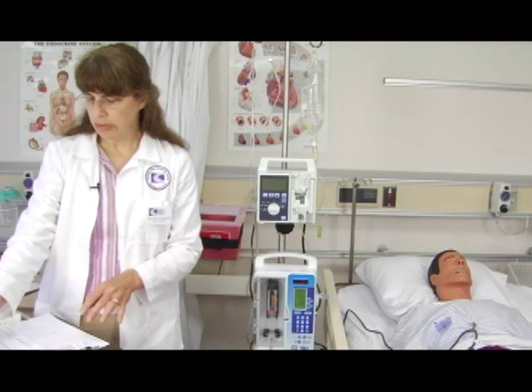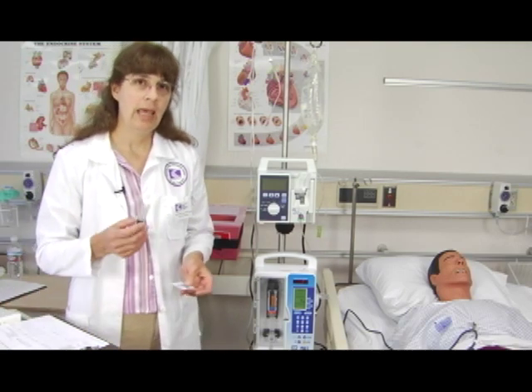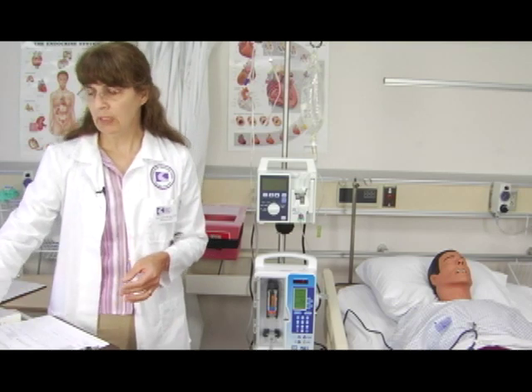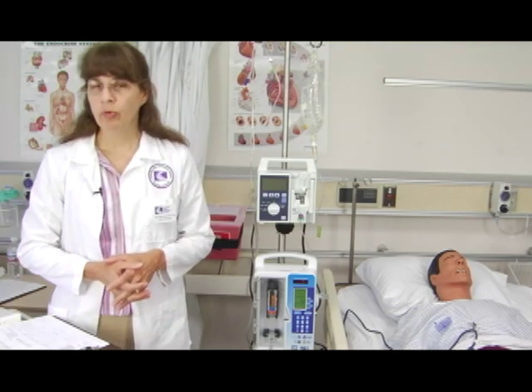A couple other items: you'll want some alcohol swabs and a normal saline flush. Next, we're going to talk about the process for recording this procedure.